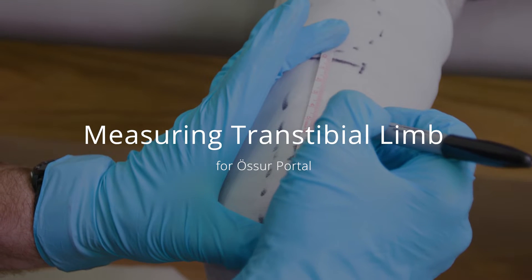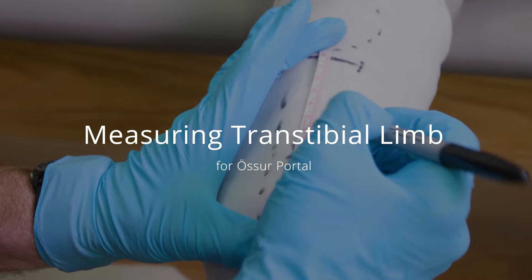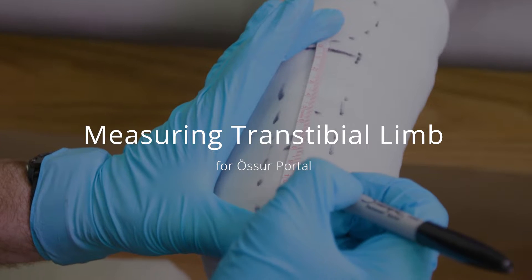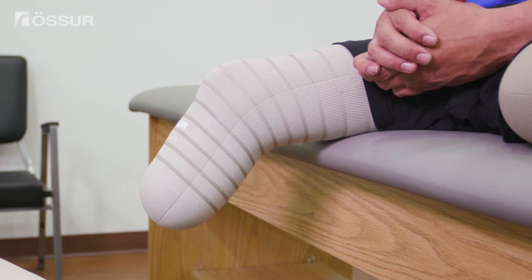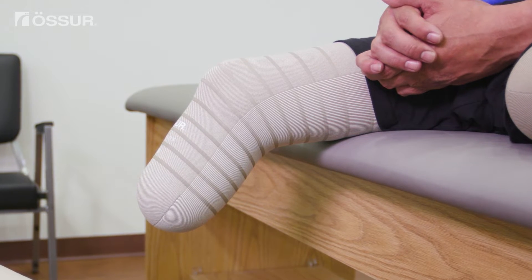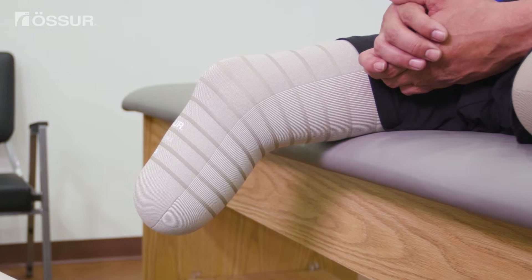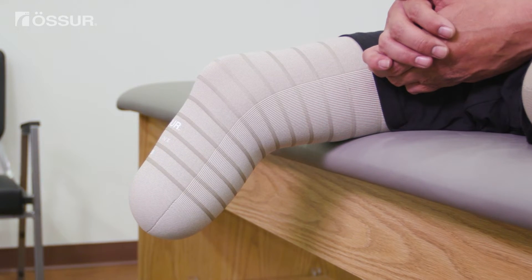This video demonstrates how to take measurements of a transtibial residual limb for the Össur Portal. Keep in mind that all measurements and scanning should be performed with the amputee wearing the type and thickness liner they will use with the new socket.